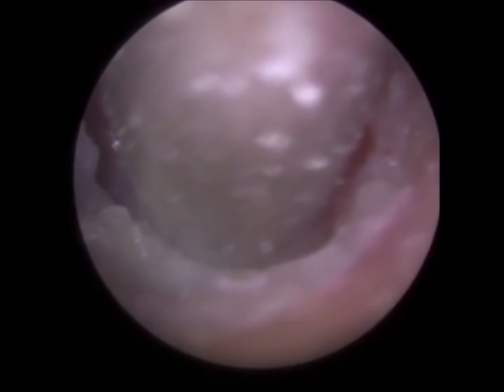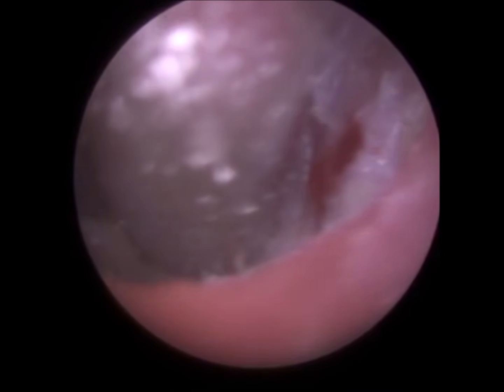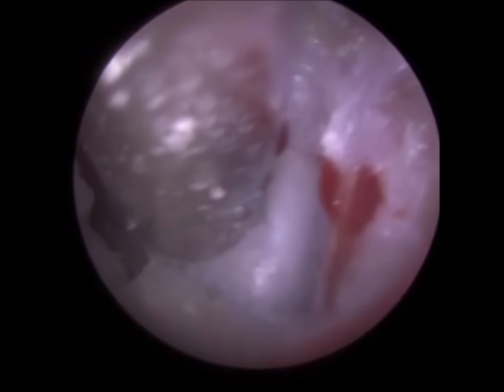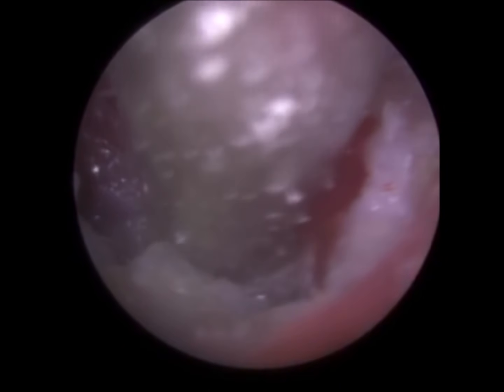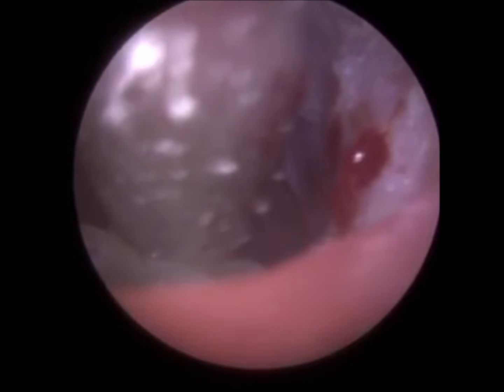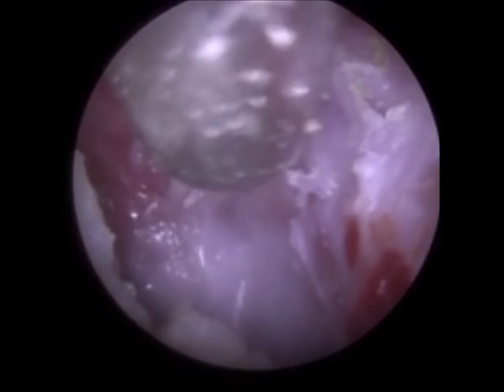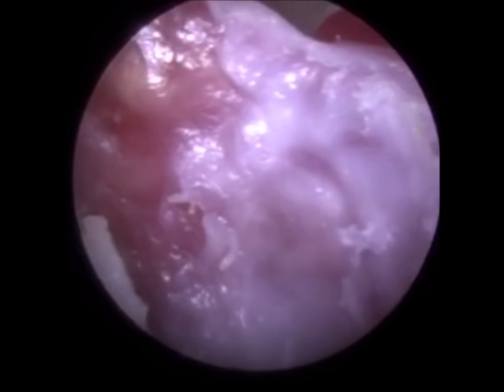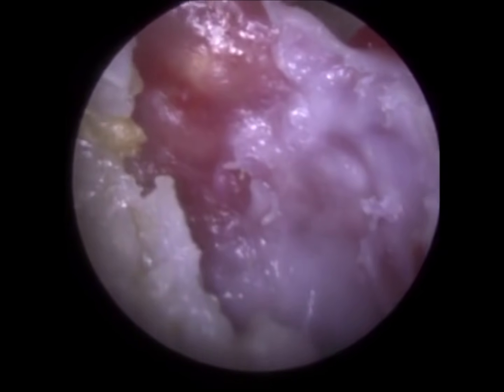So when you peel some of this keratin, you're going to get some oozing of blood. It's not because we've scratched anything or caused any trauma. That's what happens when you remove thick layers of dead keratin. You're going to get a bit of bleeding because you're exposing some of the structure. So this is a much better and clearer view of the second crater. So this is to the left of the major one to the right. Still got a bit of keratin.